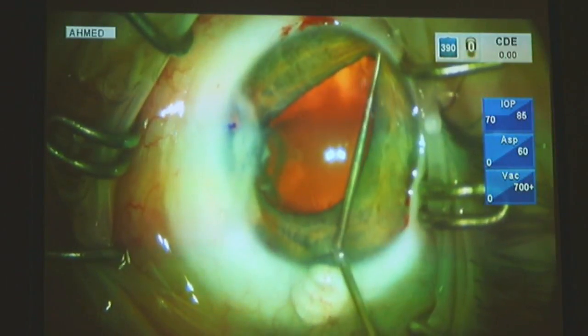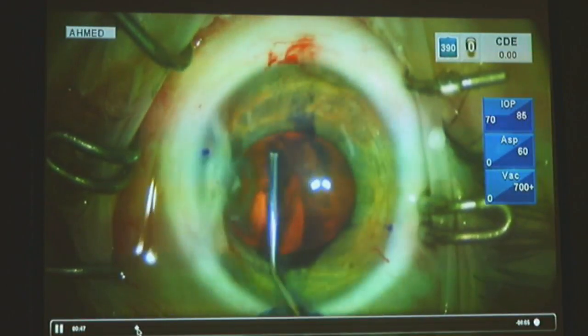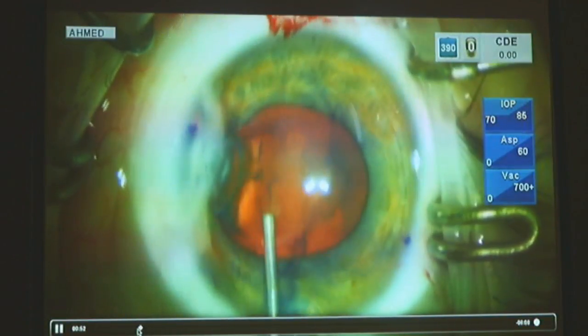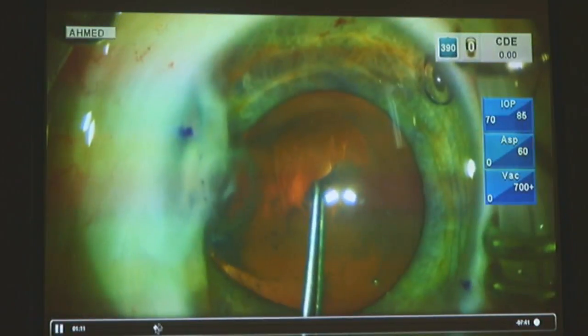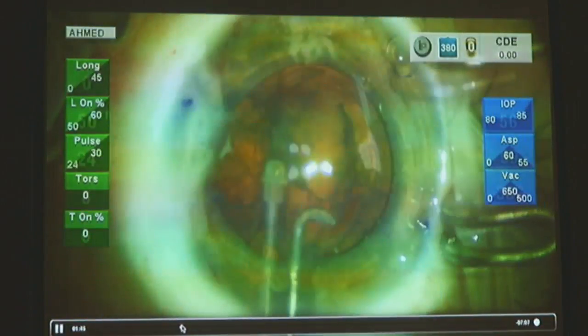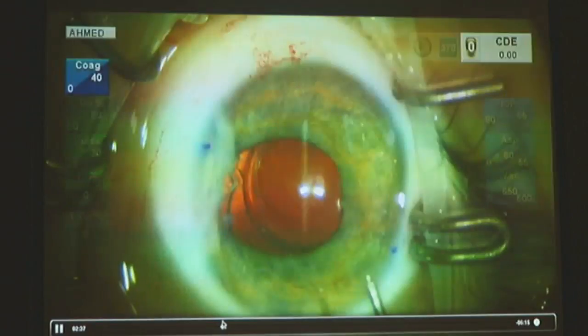You can see the fibrosis from the capsular bag to the cornea, and the lens is a bit tilted. This patient has about 5 diopters of regular corneal cylinder as well, but the rest of the zonules were okay. I like to put some trypan blue under viscoelastic so it's nice and controlled, just a little bit in. Do our capsulorhexis, avoiding the area of the trauma, and then do some viscodissection. This is a soft lens, removing it, putting a toric lens in.